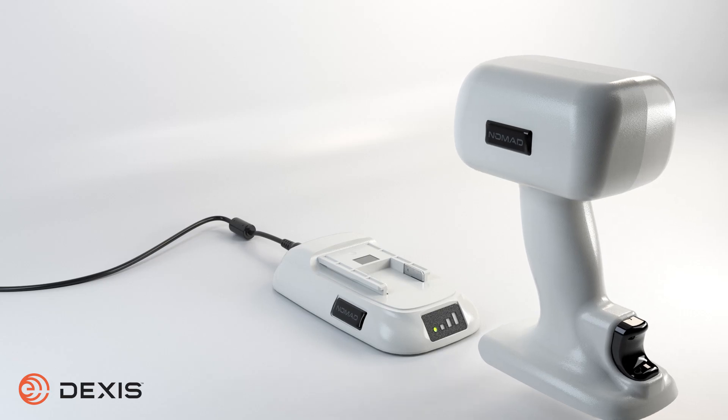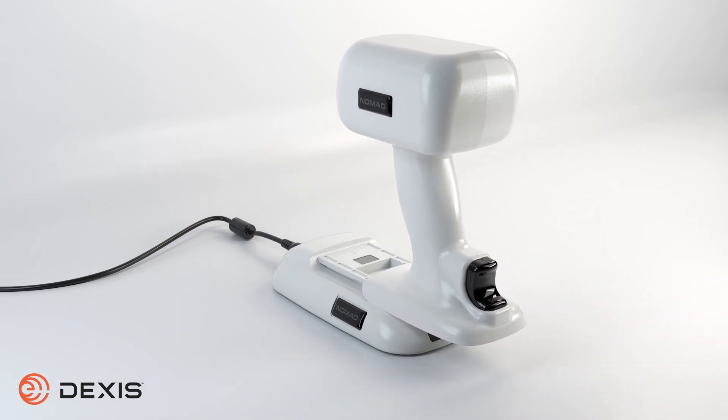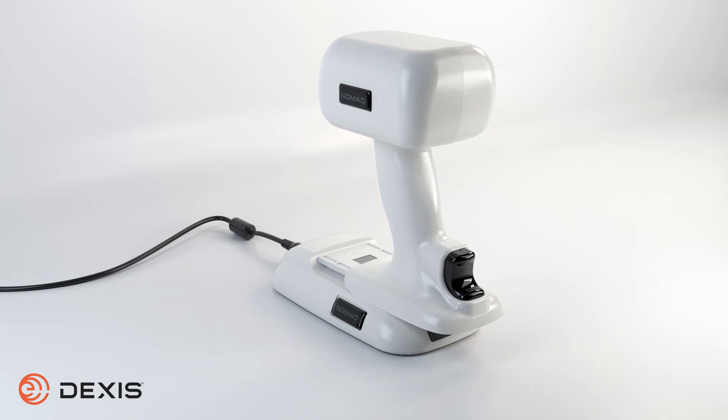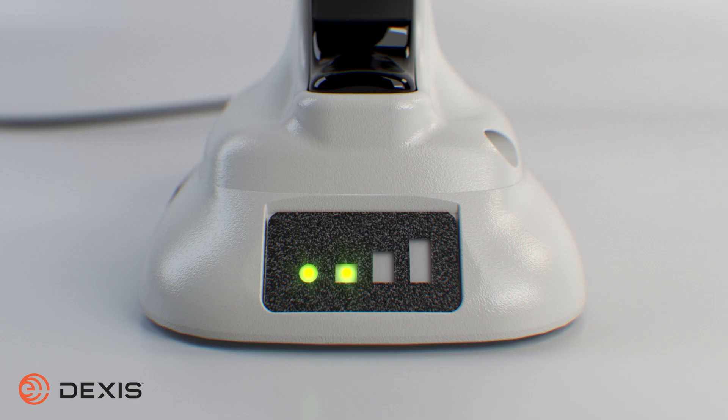To connect your rechargeable handset to the charging cradle, align the handset with the tracks on the charger. Slide the battery handset onto the charger until it is fully seated. The bars on the charger will indicate that charging is in process. When fully charged, all three green bars will illuminate.